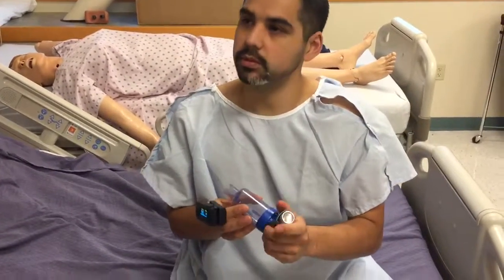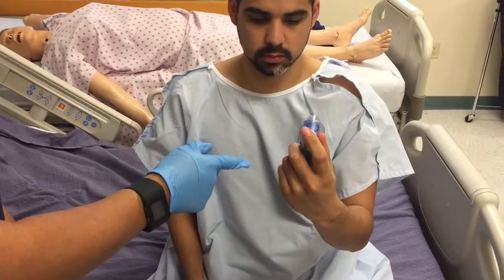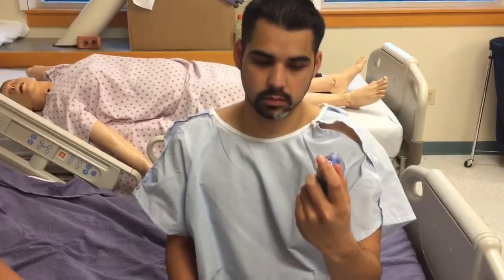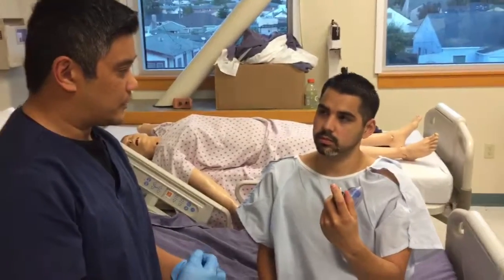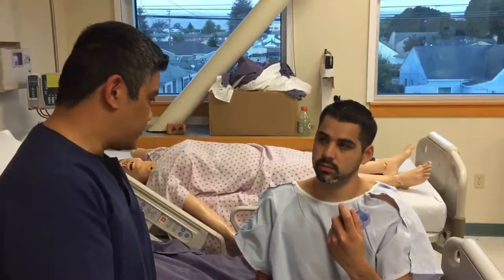Right. So when you're ready to take it, go ahead and actuate the device so it'll have a dose ready in the chamber for you. And when you take a breath in, just when you finish, hold on to that breath for about 10 seconds. It helps, again, get the medication to where it needs to be. So if you go ahead and do that for me.